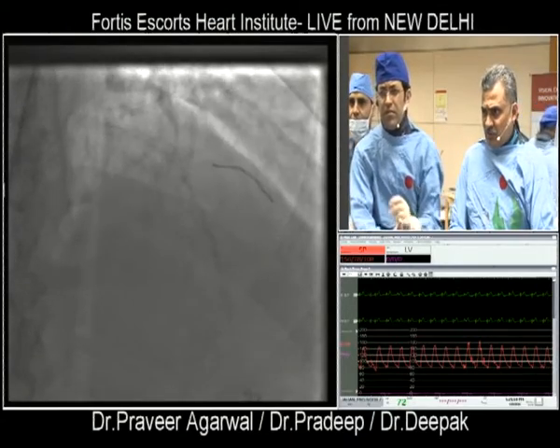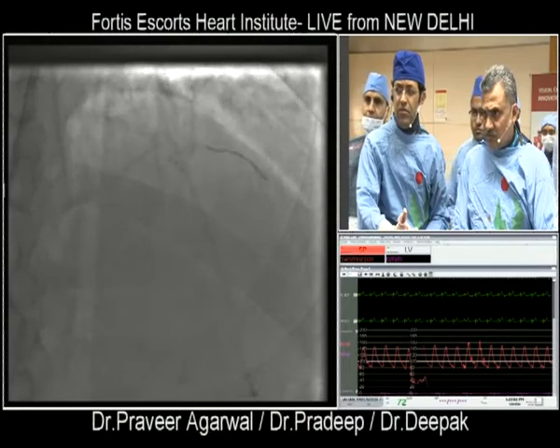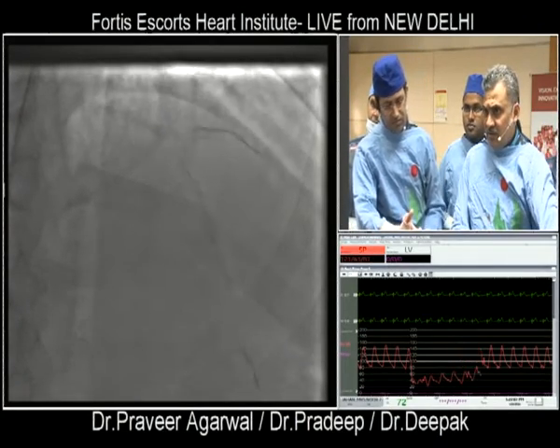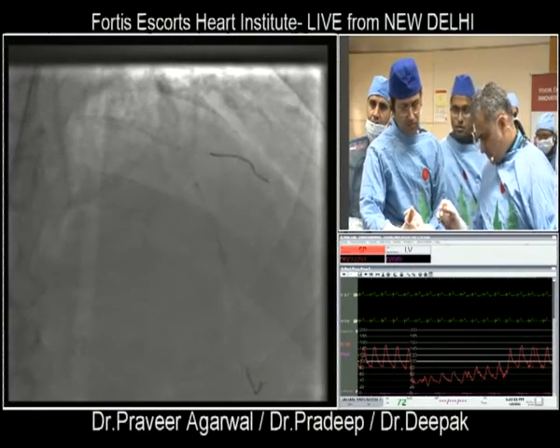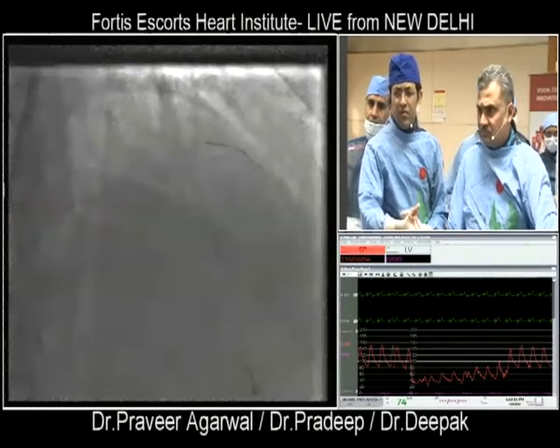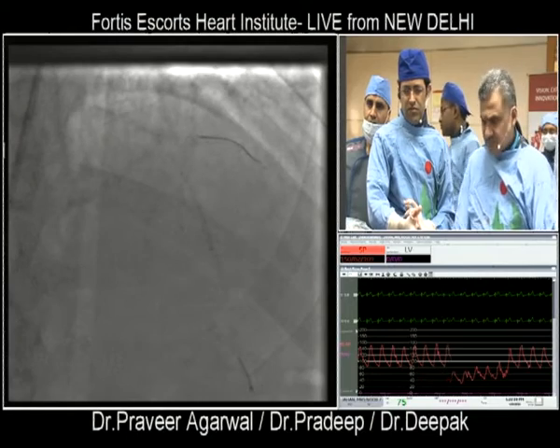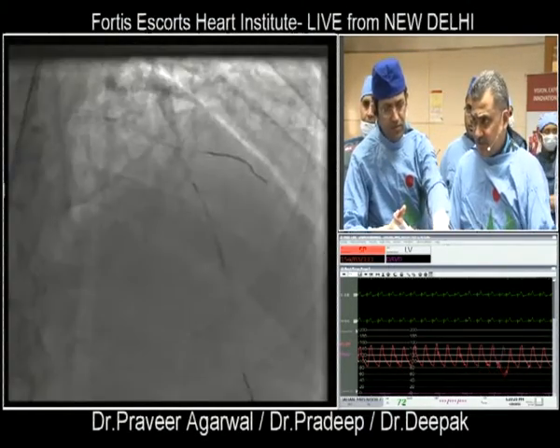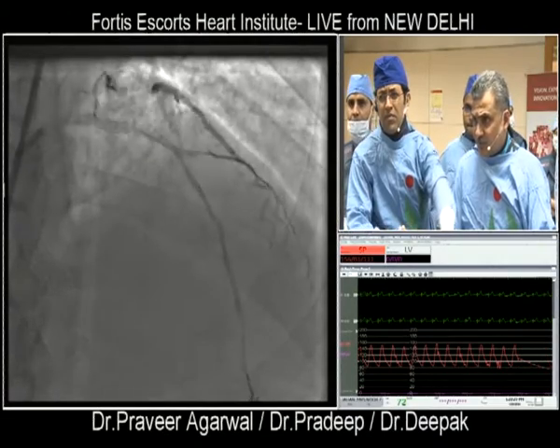Now, would you like me to cover the old stent a bit or not? What size is the stent? Sorry, you missed that. It's a 2.5 by 24, by my measurement. I would put it just in proximal. Okay, overlap. Let me just check it. Yeah, I'll just do a proximal overlap a small bit.